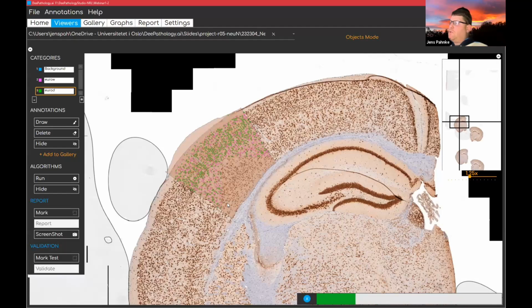It's really cool. If your staining is done in a proper way, so the quality of the staining is good, then the results will be good. If the staining is not as good, you can teach the system also. It doesn't matter, and it will give you results, but you may have to think about whether all the objects that you detect have the right color or not. You may have to group brighter and darker stained things together in a single group.